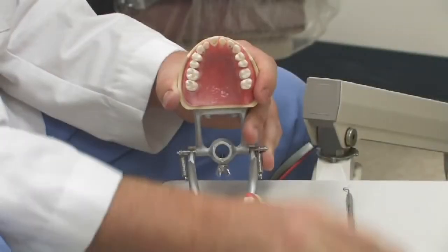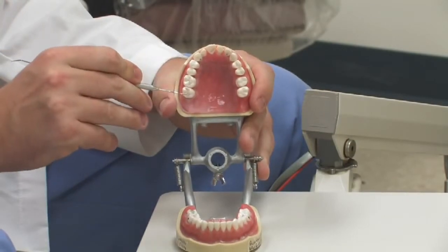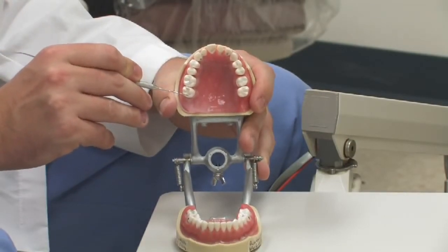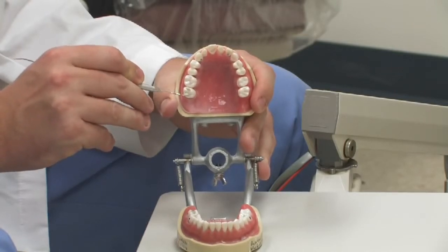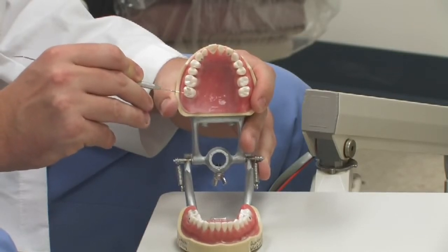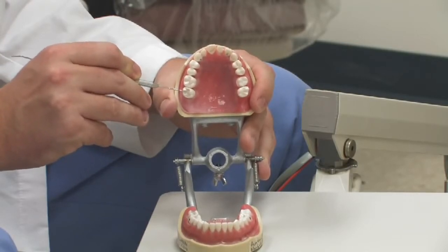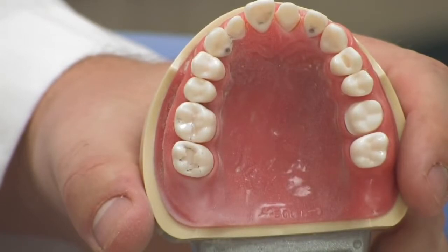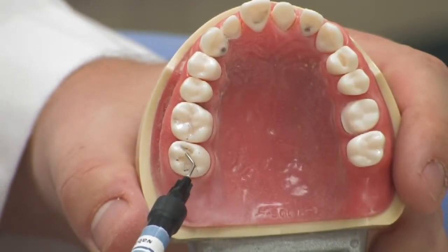Once we've cleaned out the cavity, what we'll do next is go in with our instruments and check to ensure all the stain is removed and there isn't anything sticky or anything a little irritating to the tooth. Once we verify that all the cavity has been cleaned out, the next step is to do the filling. So we take our tooth-colored filling material and gently add it to the space where we had taken the cavity out.